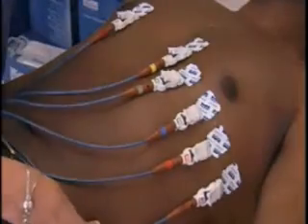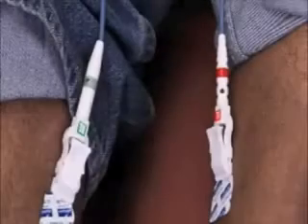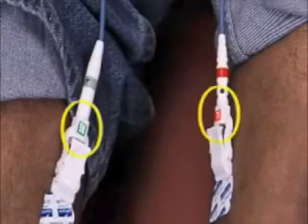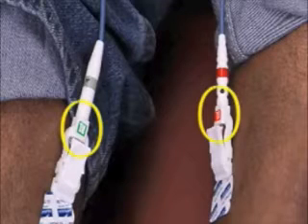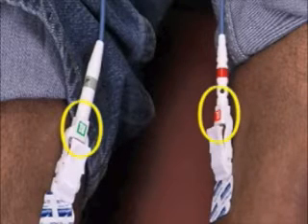Help buttons are available in all screens to assist you. Just click on the help button to access information about the screen you are in. This concludes the IQ ECG clinical instruction video.